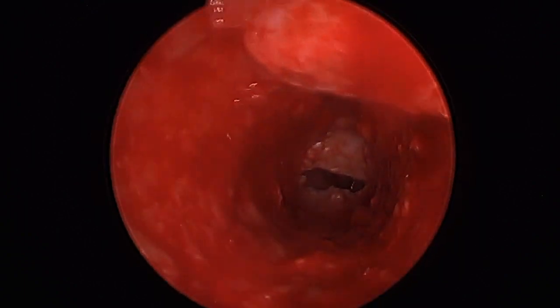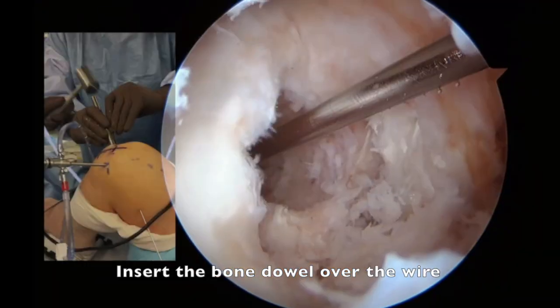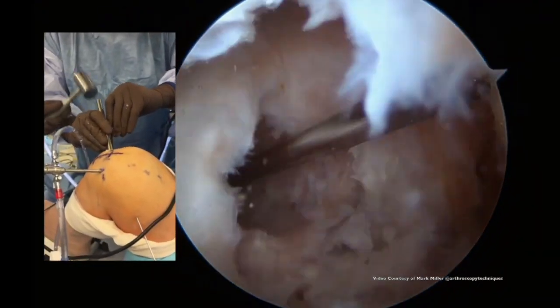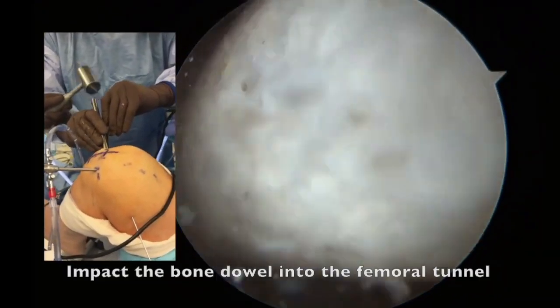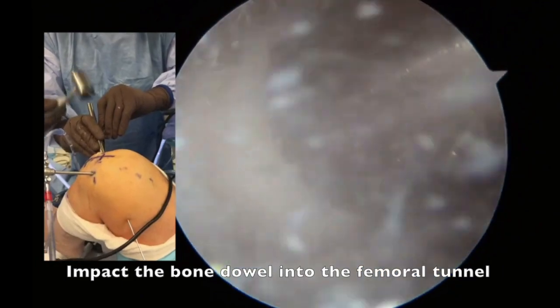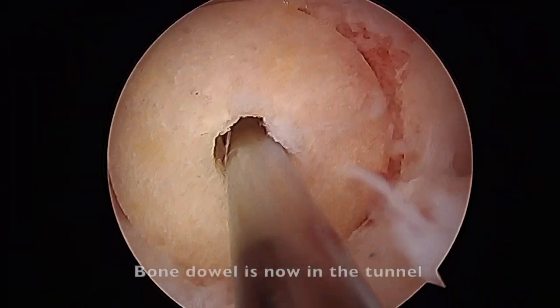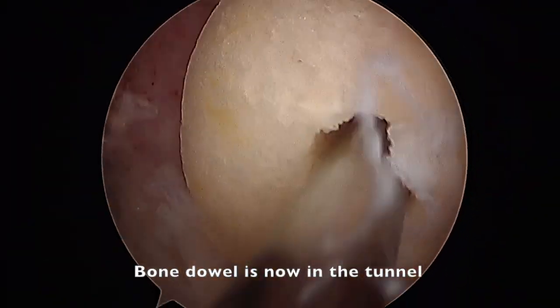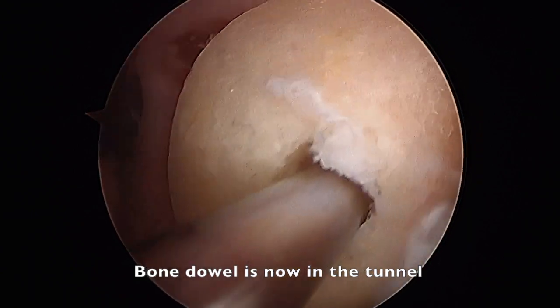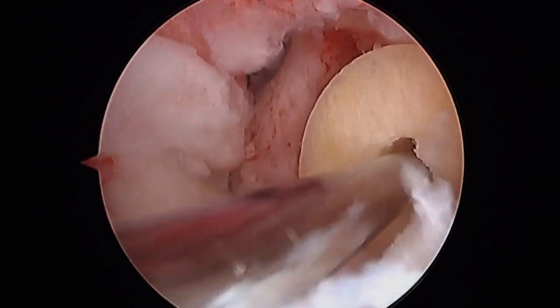The diameter of the femoral tunnel is noted and the same diameter femoral allograft bone plug is impacted into place up into the femoral tunnel. The bone graft essentially plugs the femoral tunnel and allows for bony ingrowth of the patient's own bone.